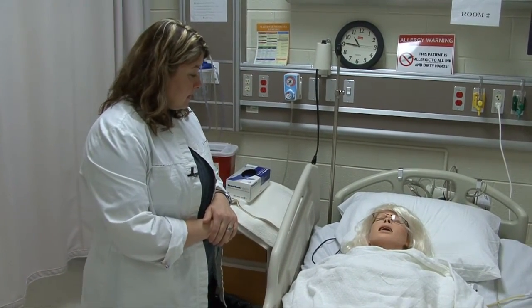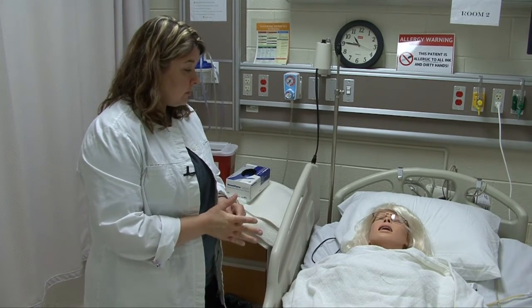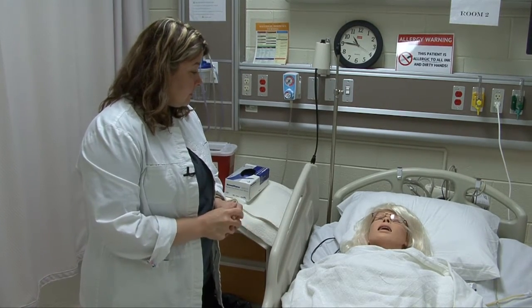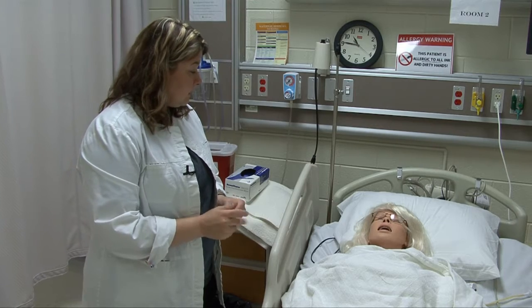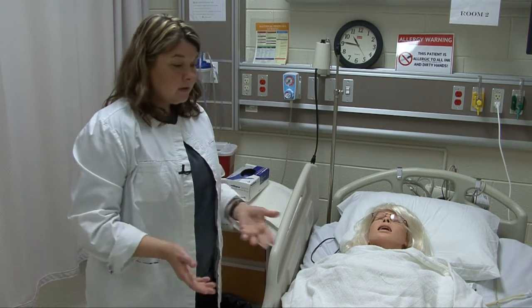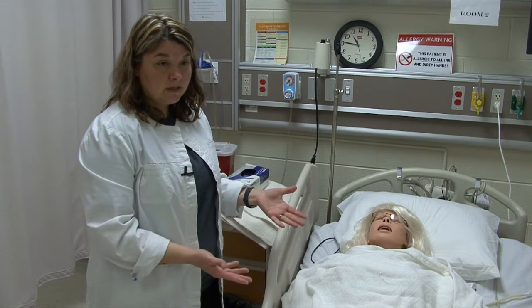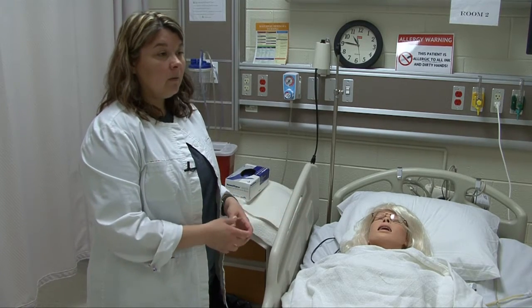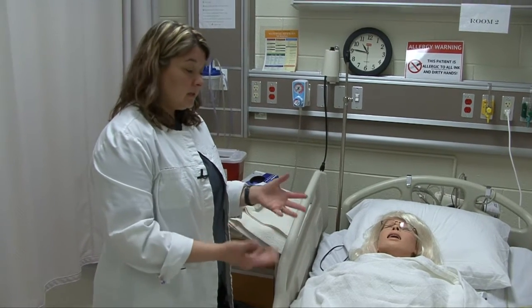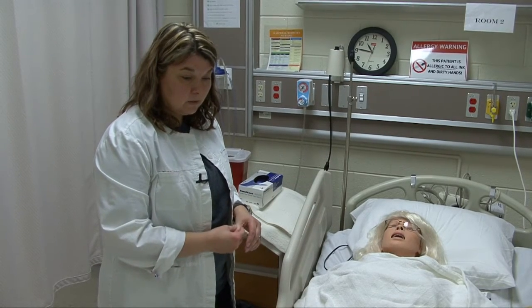The doctor has said that it's time for the catheter to come out. You had it in for your urinary retention after your surgery, it's been a couple of days, and it's ready to come out. I acknowledged the patient, introduced myself, and explained the procedure. I'm going to tell her it's probably going to take about five to ten minutes to remove it.